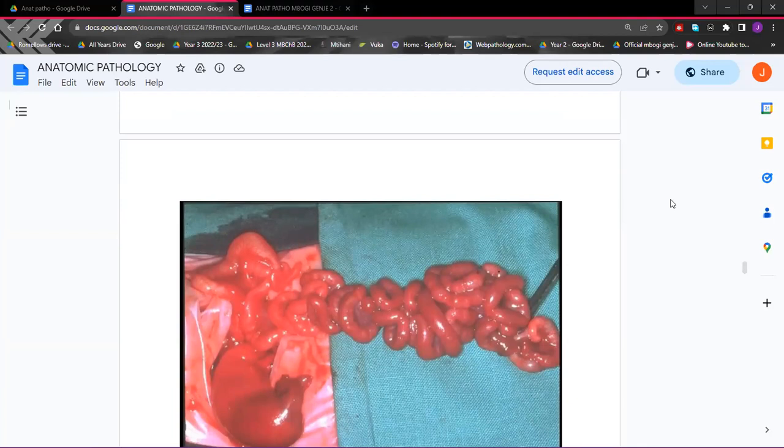Okay, maybe let's describe the gross morphological features of this pathology here. I agree, yes. Any other thing? Maybe the color, size, hemorrhagic areas evidenced by a reddish color, right? I agree. Anything else? So, what is the correct identification of this pathology?